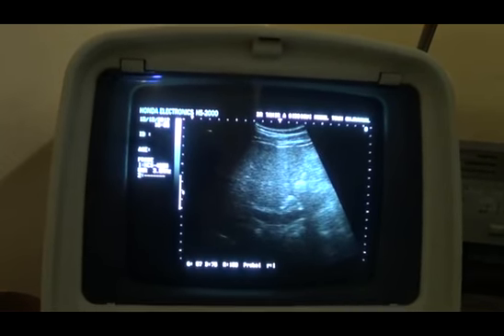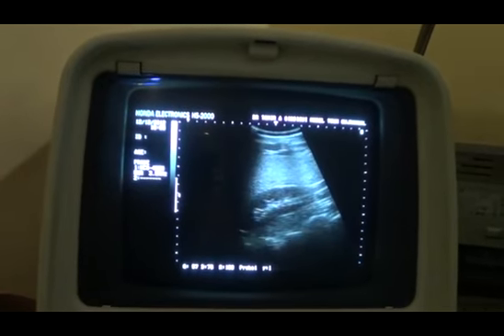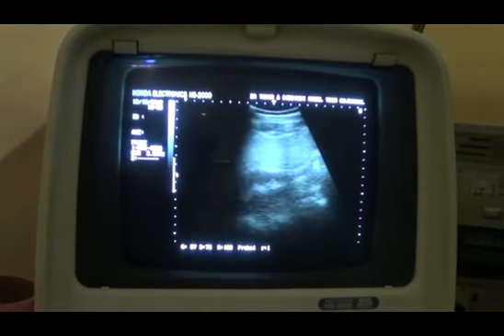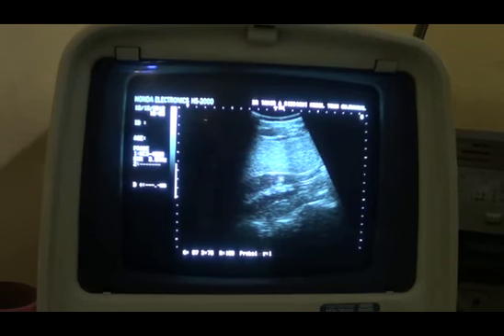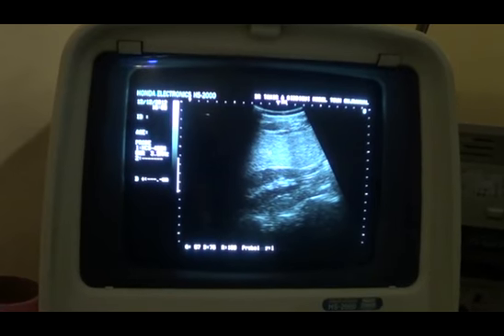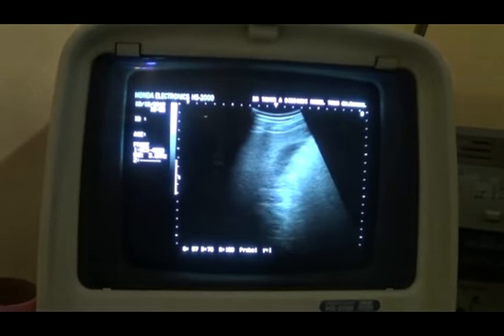These are the periportal echoes. Comparing the parenchyma of the kidney with the liver shows that the echogenicity of the right kidney has gone down a bit as compared to that of the fatty liver anterior to it. The wall of the gallbladder is not thick.